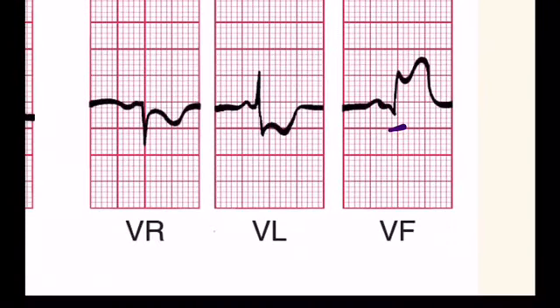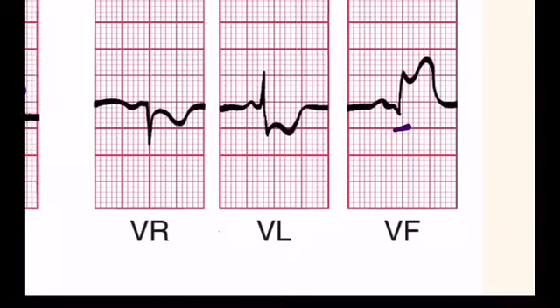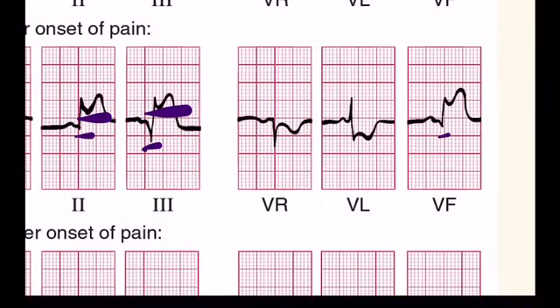Now can we signify the position of the infarction by just looking at this ECG? Can you tell me the position? It is located in the inferior side of the heart. Why? Because there is Q wave present in lead 3 and VF. Although we will be going for further diagnosis of this, the expected site of this infarction is the inferior side.